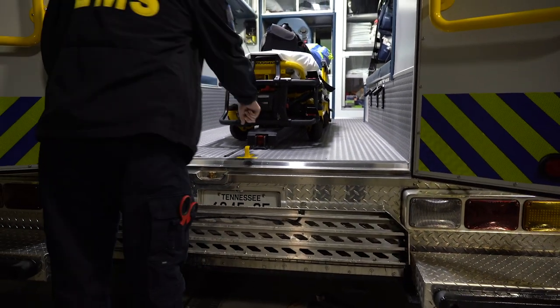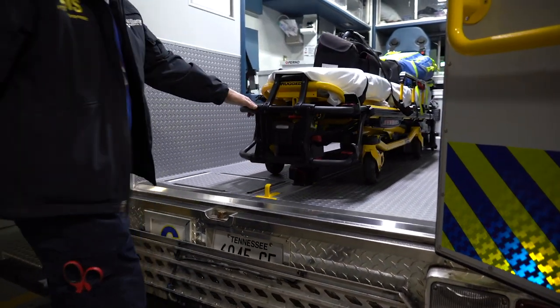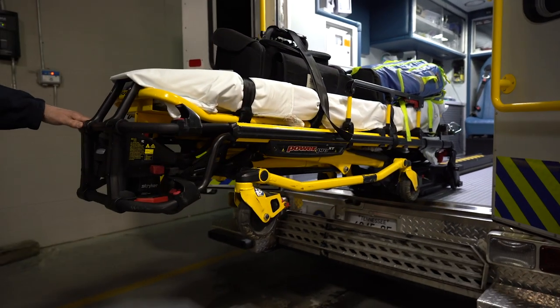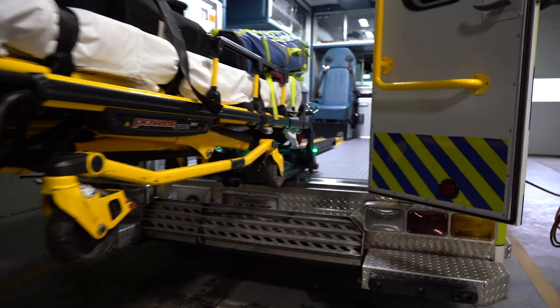All we have to do is push the red button here to make it release. Then we pull gently on the stretcher and it comes out. When it locks into place, we'll have green lights showing on our stretcher.